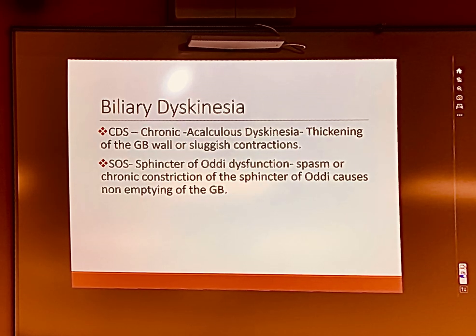So the difference between the hepatobiliary and the hepatobiliary with ejection fraction is that after 60 minutes, if everything is visualized, then you start the CCK? Yep, you give CCK at that point. But it goes back to, you have to make sure you have liver, gallbladder, and bowel before you give the CCK, because you want to make sure that your patient doesn't have cholecystitis or blockage, right?